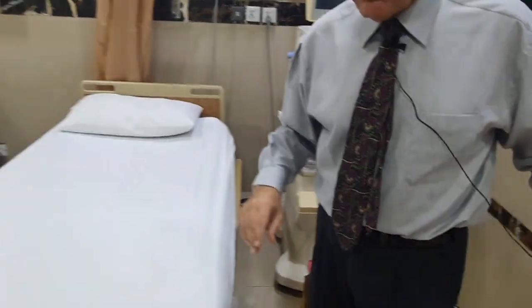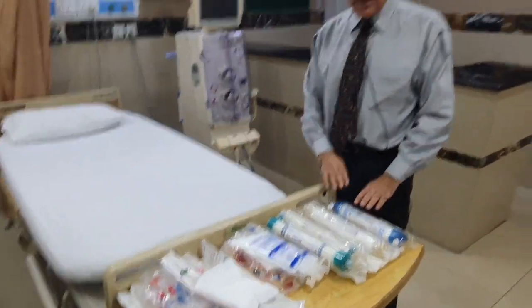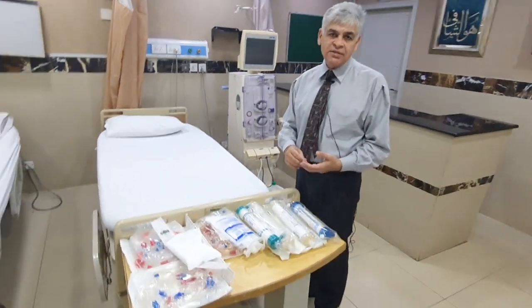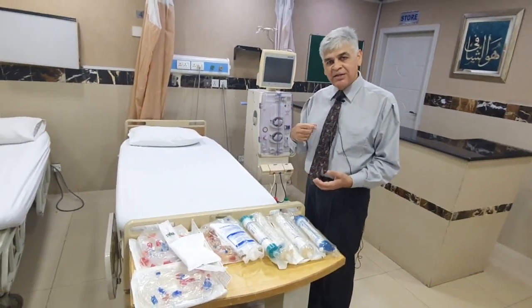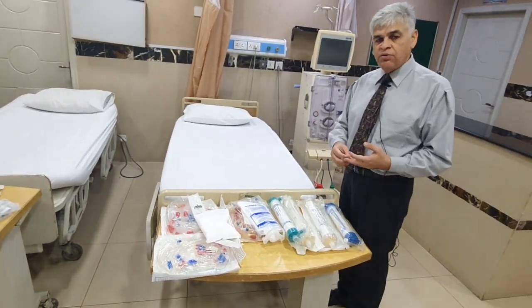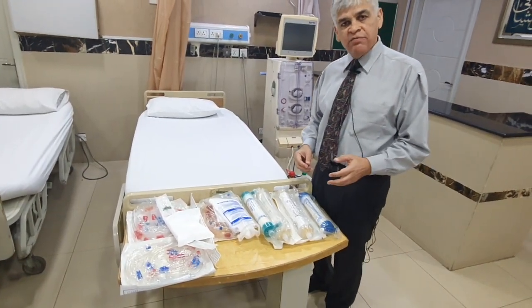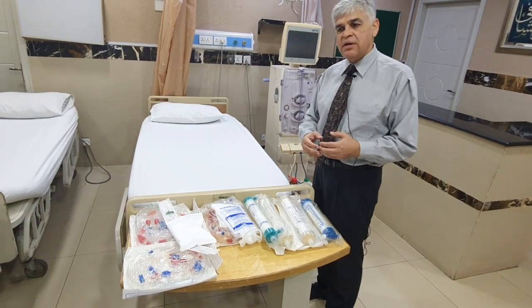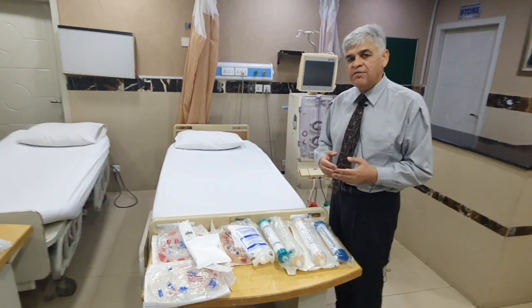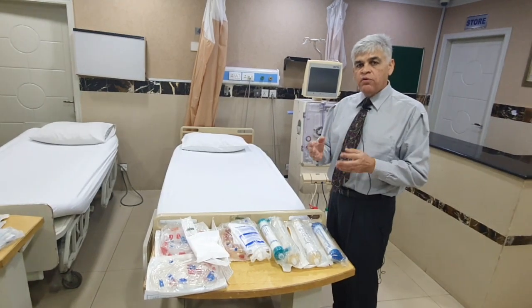But first, let me show you a few other things, and that is the dialysis disposables. Now, what you need is a vascular access. You need somehow to access the blood. Either that is in the form of a dialysis catheter, like a permanent dialysis catheter, or by means of an arteriovenous fistula or arteriovenous graft. And you can access the graft by different needles, and these needles are of different sizes. It's just like you get a Foley's catheter, or an IV Venflon. These are of different sizes, and the sizes are there for the particular patient.